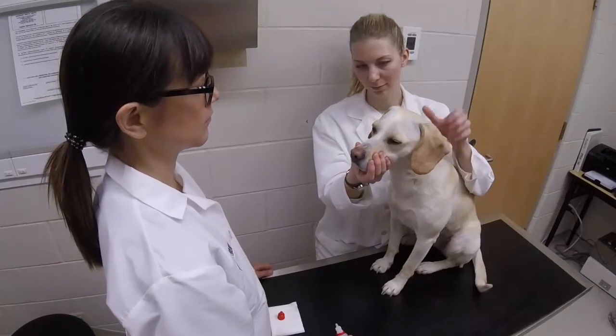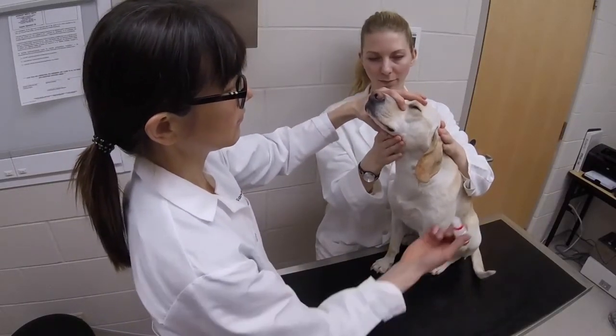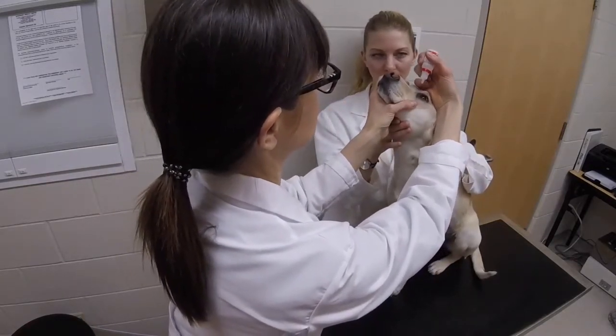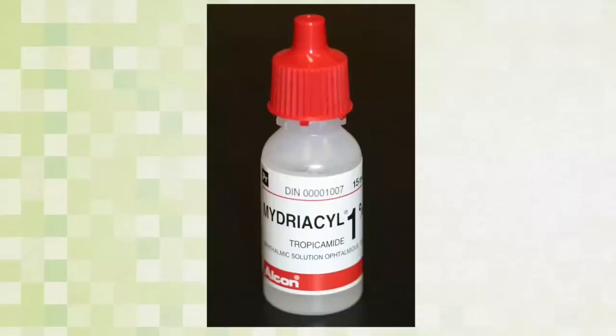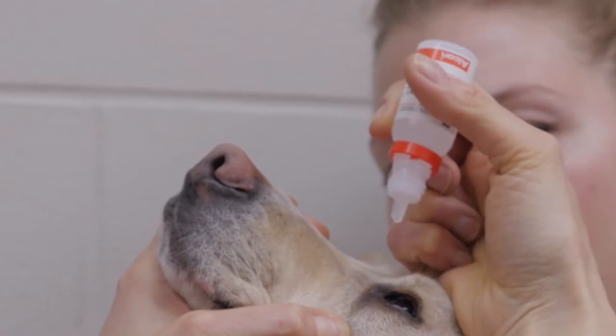Most mydriatics take approximately 20 minutes to have an effect, and so to conserve time in an appointment, it is recommended they be given early in the examination. The mydriatic of choice is 0.5 or 1% tropicamide, as it has a rapid onset of action, approximately 20 minutes, and a short duration of action of 2 to 4 hours.